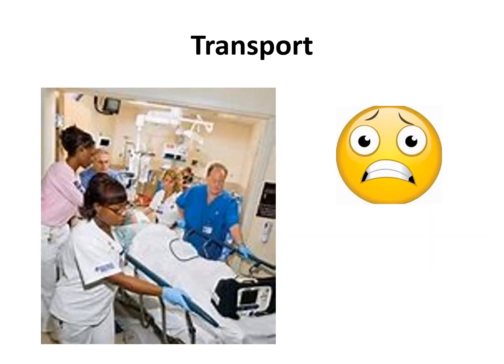Transport. Transport is a very high-risk time for incidents to occur. The number of people needed for transport can be determined by how critical the patient is. But you have to ensure that the lines and the tubes are protected at all times and try to limit the transport as much as possible. This requires extensive coordination, communication, and setup. The receiving area and respiratory therapy all need to know when you're going and how long you're going to be there. You may have accompanying personnel, a minimum of 2 staff, which would be the RT and the RN.